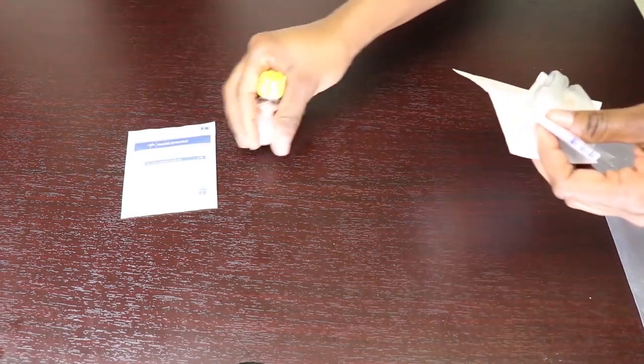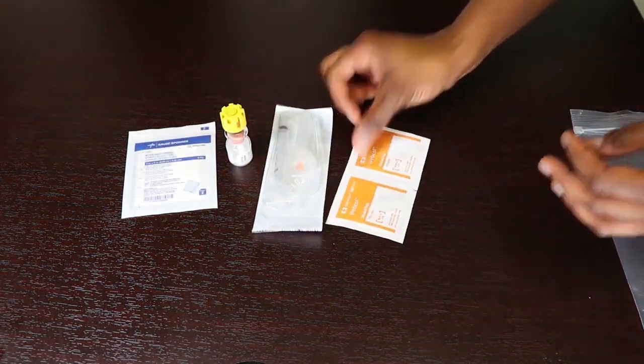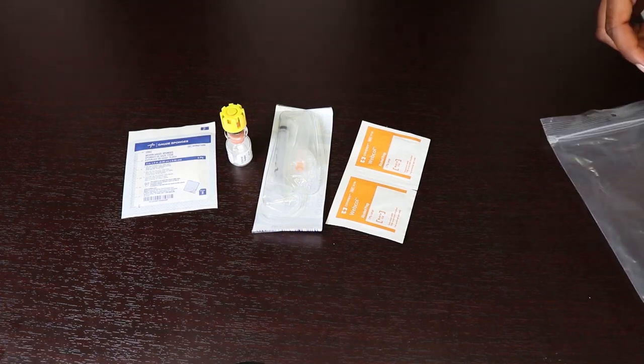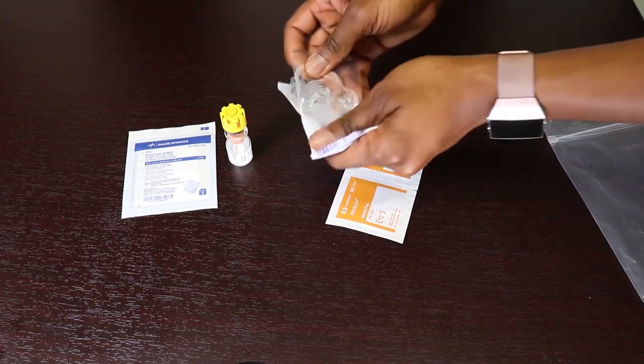Gather the equipment you will need: a medication vial, syringe with needle, alcohol swabs, and cotton tissue if available. Take the syringe and needle out of the plastic wrapper and assemble if needed.